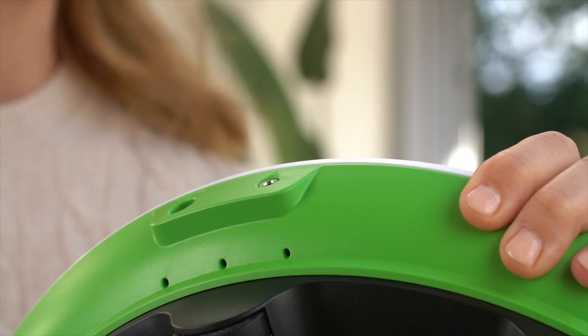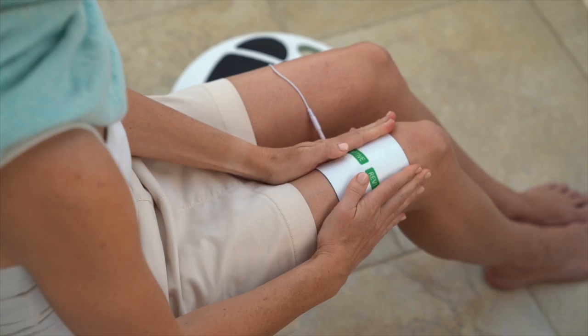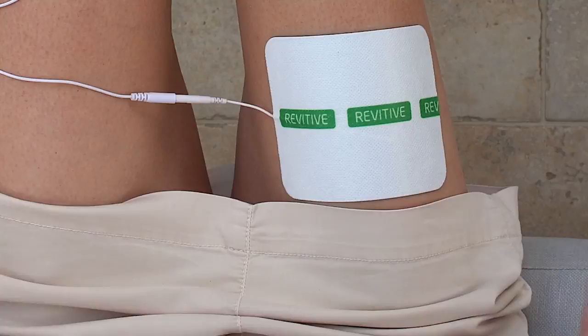Remove the plastic liner from the thigh pads by peeling it off carefully. After use, always put the pads back onto the liner to store and protect your pads. Press one of the thigh pads across the very top of your thigh, then gently press the second thigh pad across the bottom of your thigh, an inch or so above your knee.